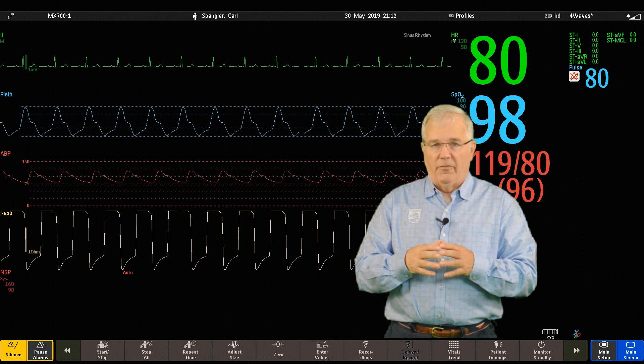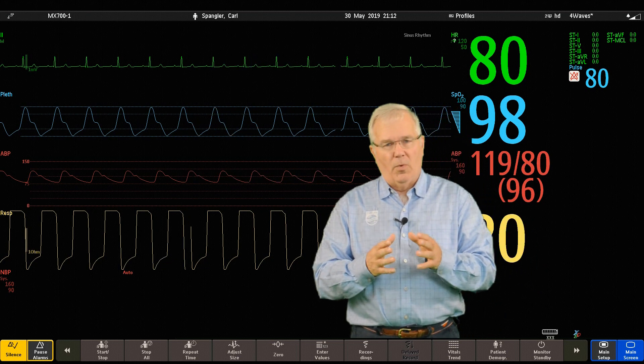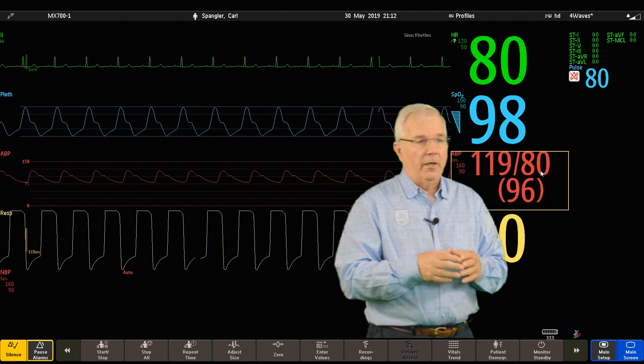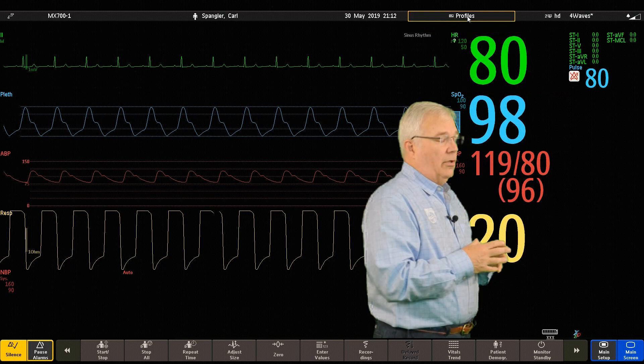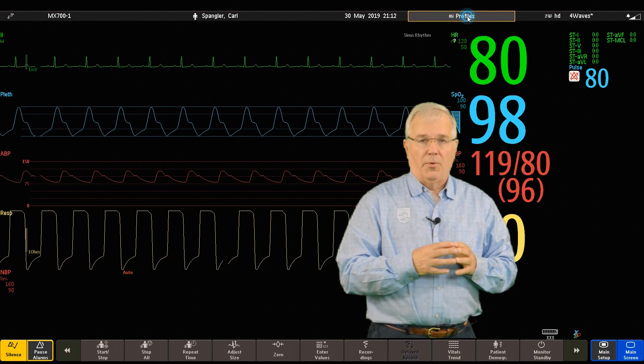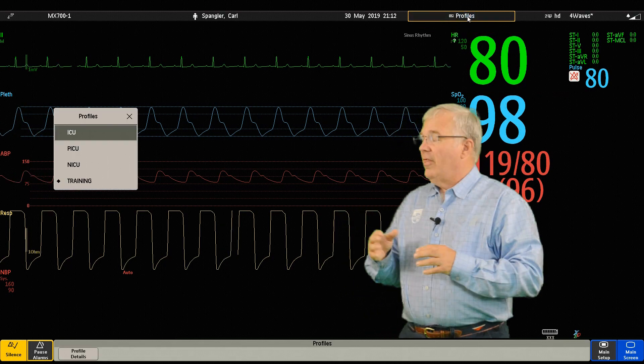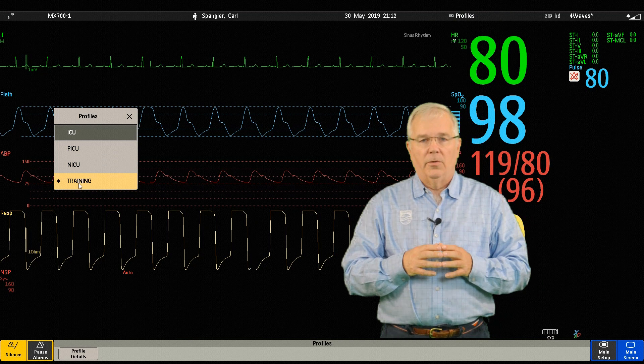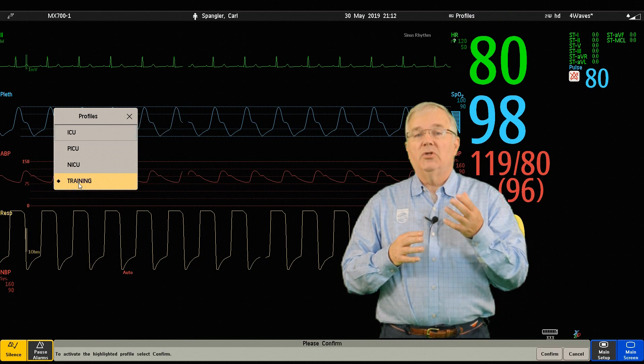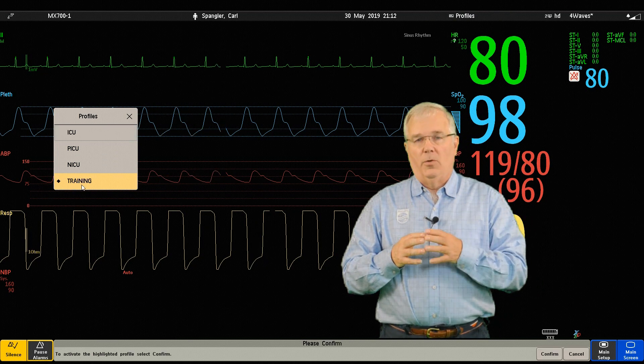Now to change a profile, there are a couple ways. One is in the information bar. You can touch the current profile. That opens up the profile menu and then you can select the profile you want.